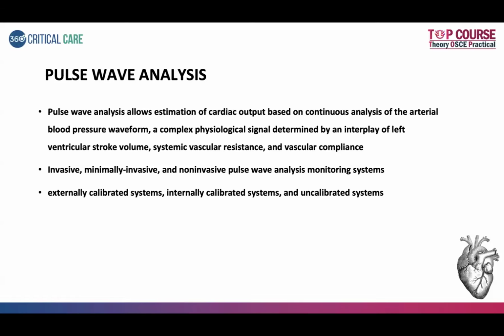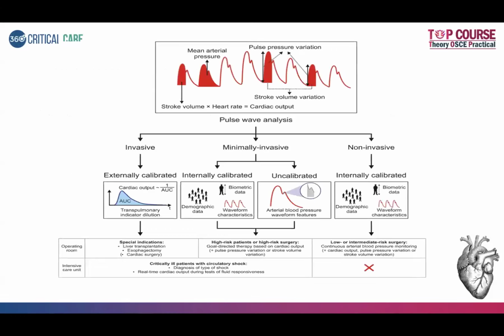In pulse wave analysis, again, we have subtypes. It could be an externally calibrated system, or an internally calibrated system, or an uncalibrated system. Basically it is nothing but analyzing the pulse. As I told you, it could be invasive, externally calibrated; minimally invasive, internally calibrated; uncalibrated; or non-invasive, internally calibrated.